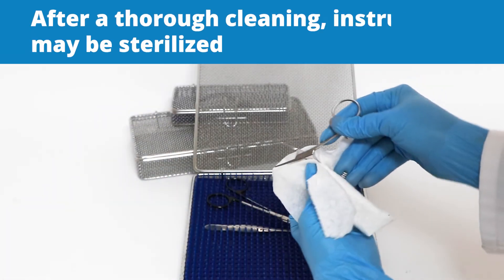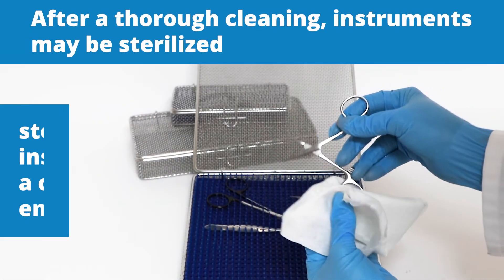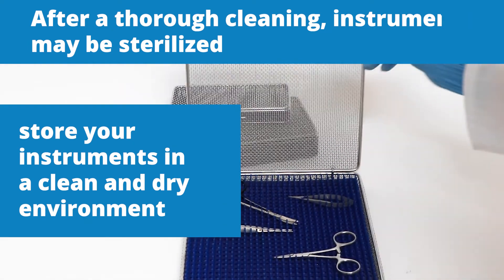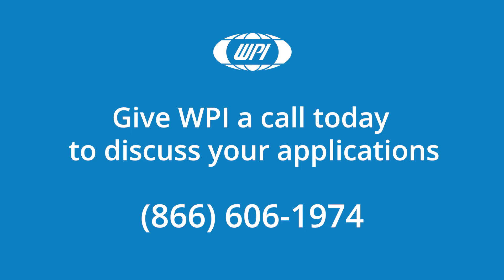After a thorough cleaning, instruments may be sterilized. Always store your instruments in a clean and dry environment. If you have any questions, just give us a call.